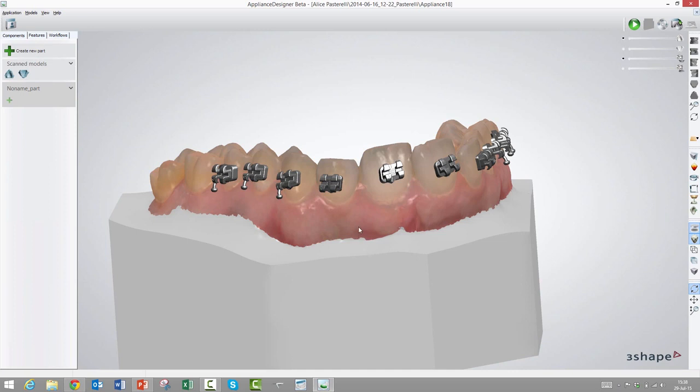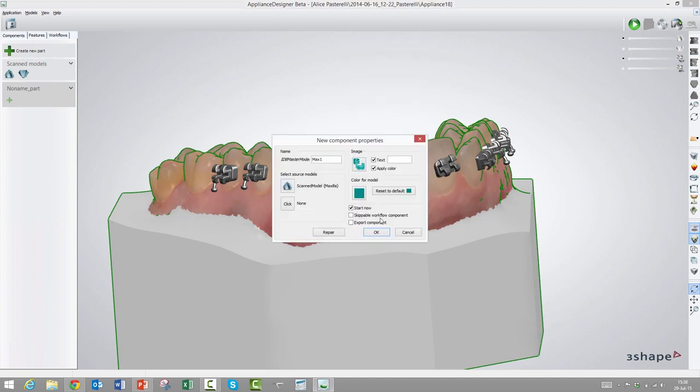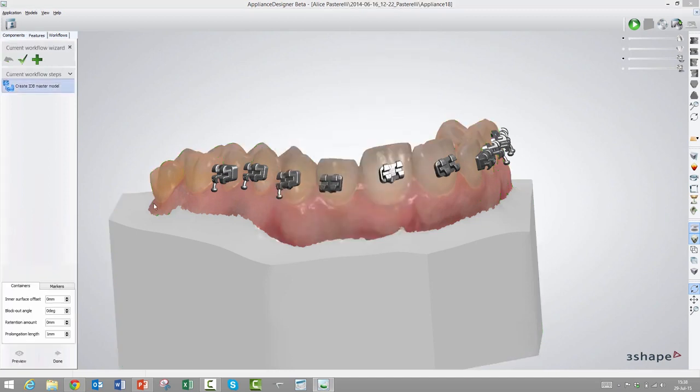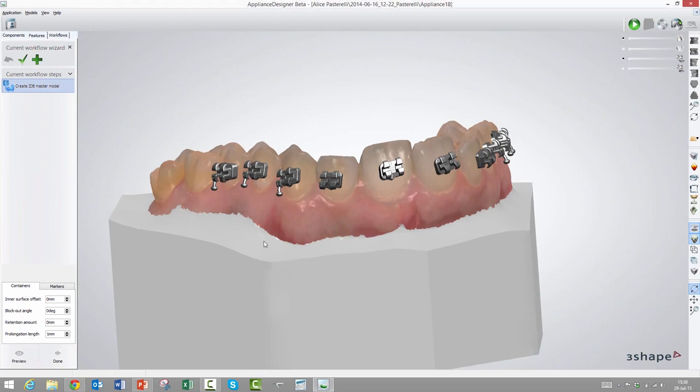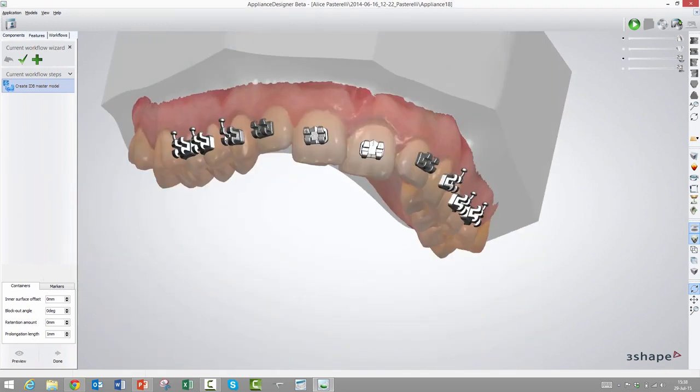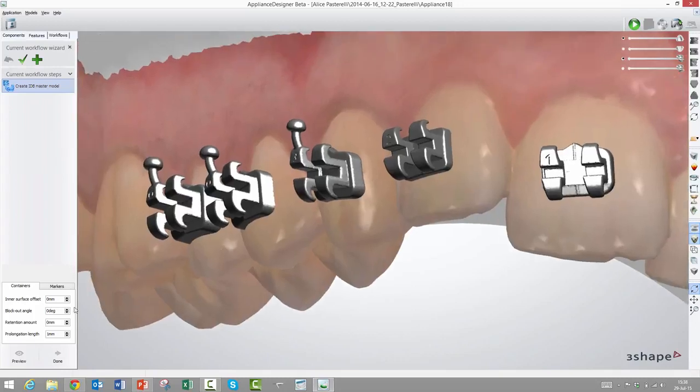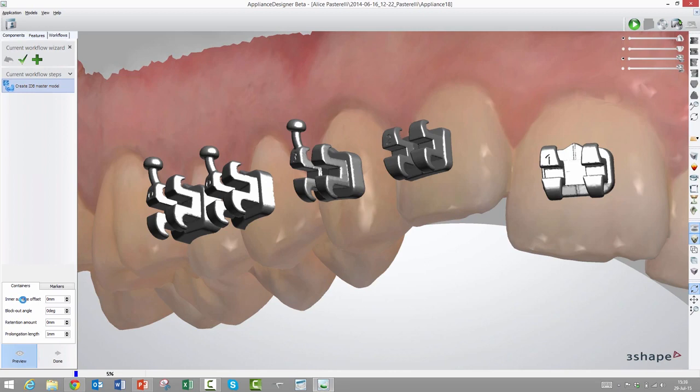Let's look at some of the more advanced ones. The next one of the transfer methods we will look into today is what we call containers. That is also something that you can thermoform on top of. So we will make this indirect bonding master model as before, but instead we will choose the container option.